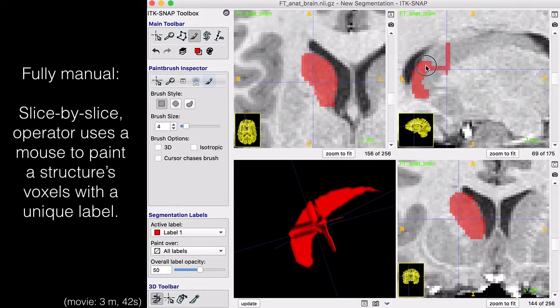And I'm actually pretty fatigued during this measurement. This is about the speed that I would go at the end of a couple hours of measuring. In this case, I'm using a pointing device that I don't usually use for measurement.